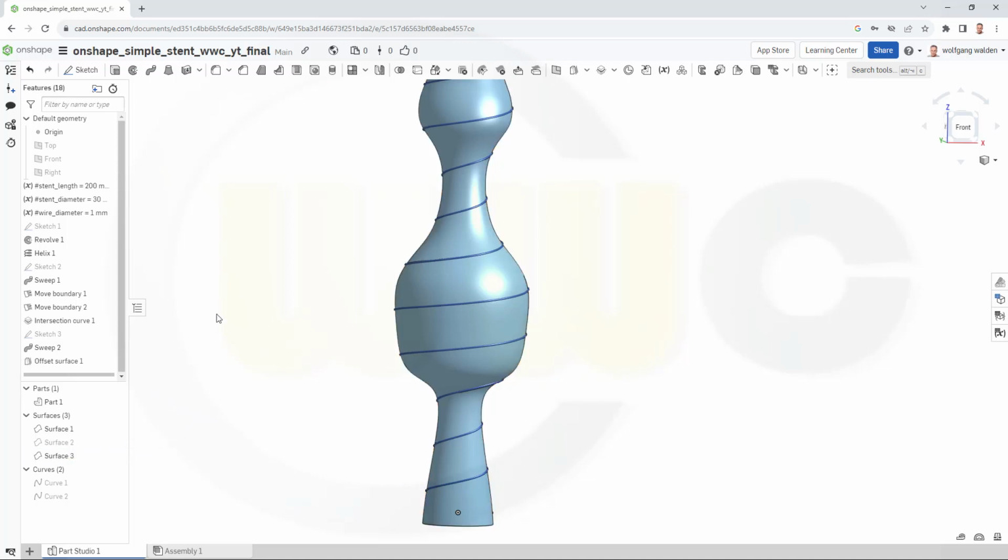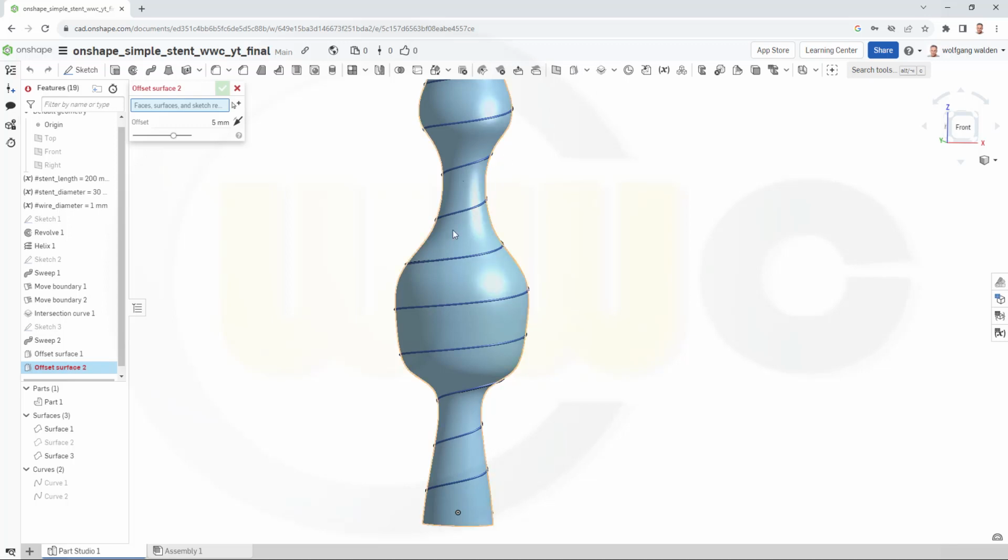And a second offset surface from the same one, but the other way around, other direction. So go again for that offset. There you go, offset surface from this surface. Again, this should be hashtag wire diameter divided by 4. And it should be the other way around. And confirm. Hide this one here.